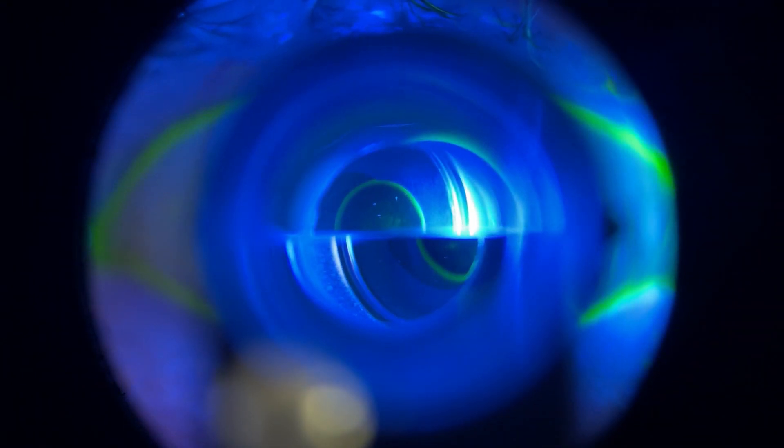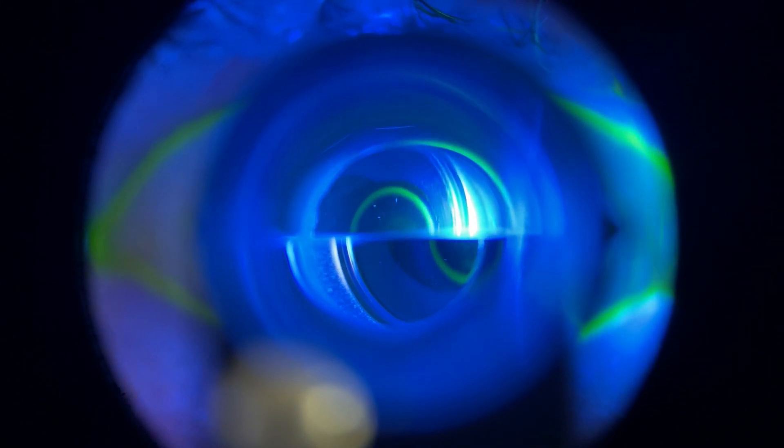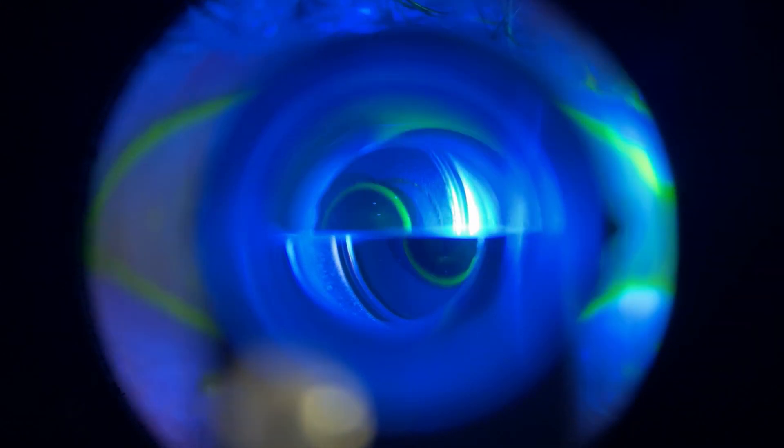Once you actually touch the cornea, two semi-circles are going to appear. They might not look perfectly centered, but we'll talk about that in a moment. What you want is two semi-circles that are the same size and touch each other on the inside of the arc. Do not put them straight on top of each other.